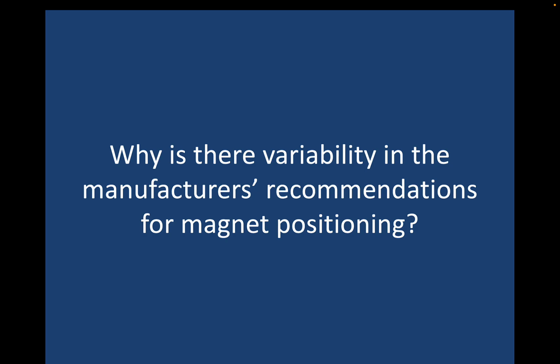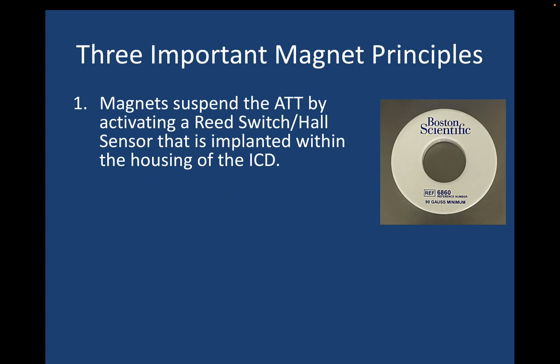Now, you're probably saying to yourself, what the heck is with all this variability in the manufacturers' recommendations for magnet positioning? I can't give you a definitive answer, but I can give you some concepts here. Three important magnet principles. Magnets suspend the anti-tachytherapy by activating a reed switch or a Hall sensor that's implanted within the housing of the ICD.